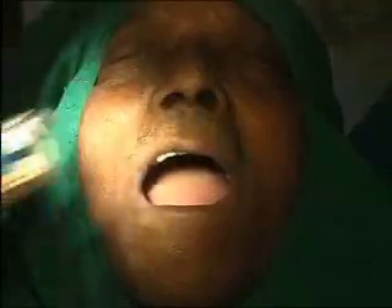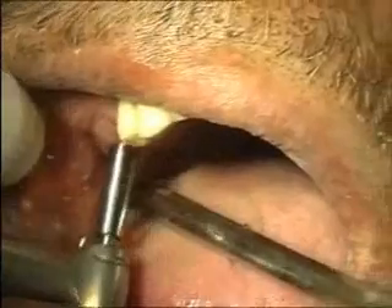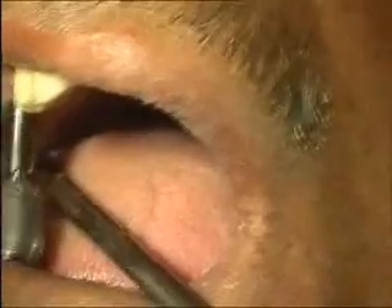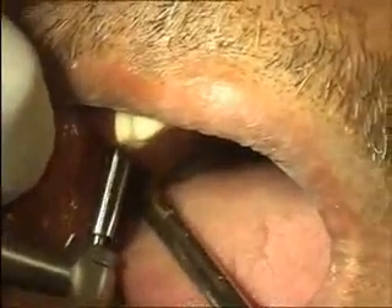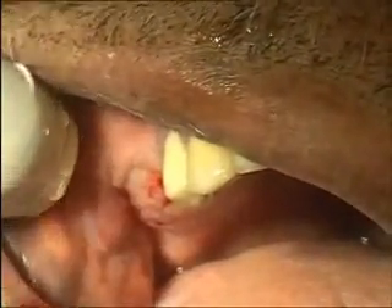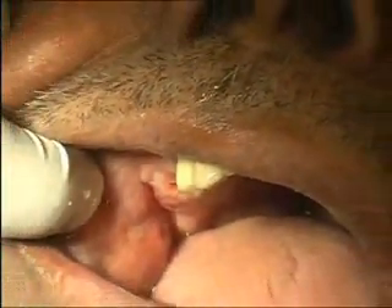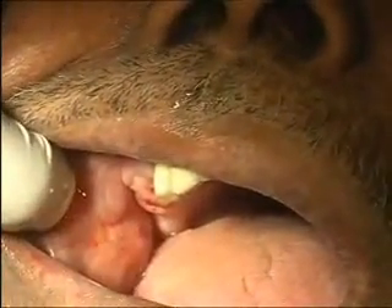Let's point the instrument over 4.1 and then 4.8. Can you see this tissue? Clearly removed. No need to do sutures. No need to do incision — take out this tissue. These are the circular tissues you can get. Finished.